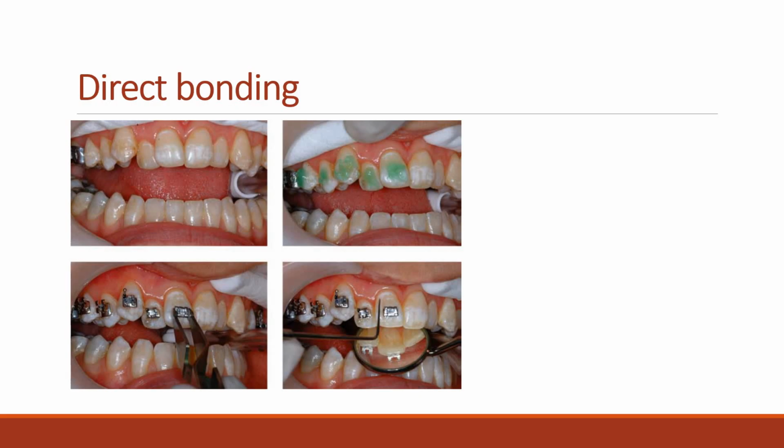Both standard edgewise and Begg brackets are simply placed at a specific distance from the occlusal edge of the tooth crown. However, this does not provide a consistent reference point, and the bracket position is determined primarily by the size of the crown.